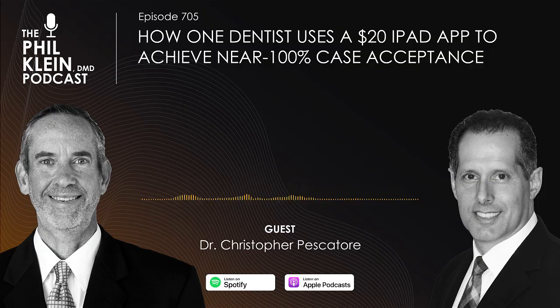Like I had a patient just last week fly in from out of town and I scanned her. But what happens if something happens to that scan, on the small percentage that it might? What happens if it gets corrupted? Am I going to fly her back and take off the temps? No, I have an impression. And impressions are still very viable in today's profession. They just are. People don't want to admit it because they want you to buy a scanner, but they are.